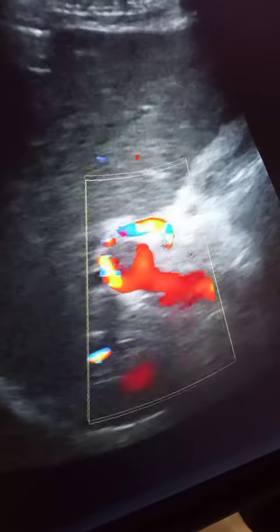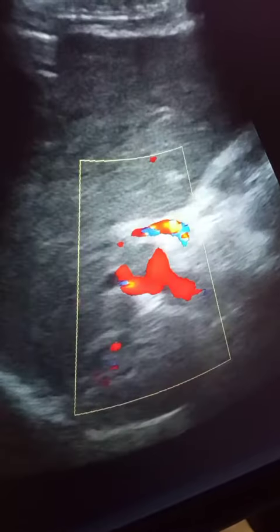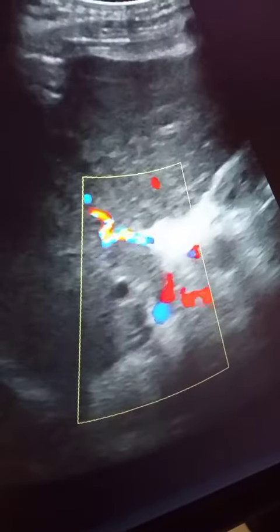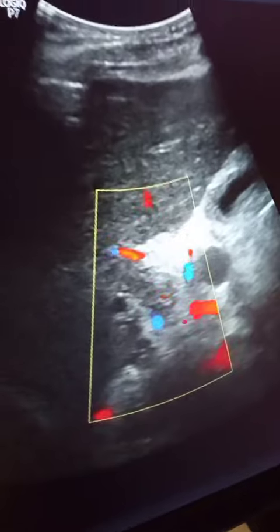Hi everyone, today we will see a case of thrombosed portal vein. Abdominal ultrasound examination has revealed presence of echogenic material in the lumen of portal vein just before its bifurcation.